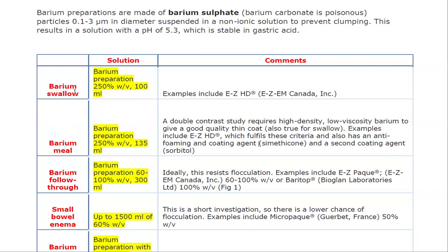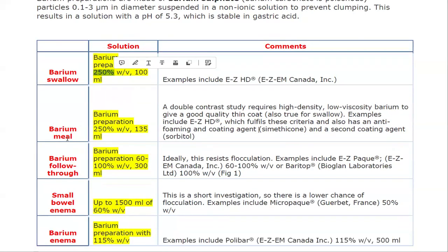When you are using barium swallow, you need something viscous to see the mucosal details, so you will use 250 percent. Barium swallow and barium meal are quite identical in indications and uses. There is no wide difference between them except in the technique of imaging itself.